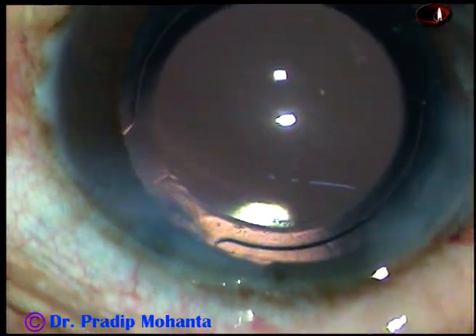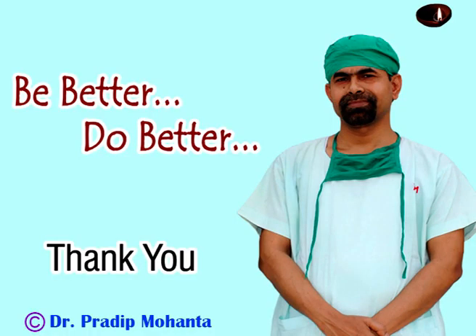The case is done. Thank you very much for your attention. Hope this video will help you in developing your surgical skills. Be a great surgeon and serve your patients with love, respect, compassion, and great surgical competence. Thank you very much.